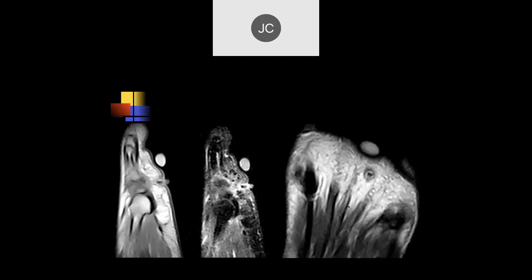There's a marker over the plantar aspect of the foot, with a focus of susceptibility artifact with surrounding edema — concerning for a foreign body. This object, which the patient stepped on, is embedded in the subcutaneous tissue with no mobile protons, so it's black. This turned out to be glass. On MRI you can see clear glass, but not on X-ray — unless it's leaded. With MRI it doesn't really matter; you can always tell.